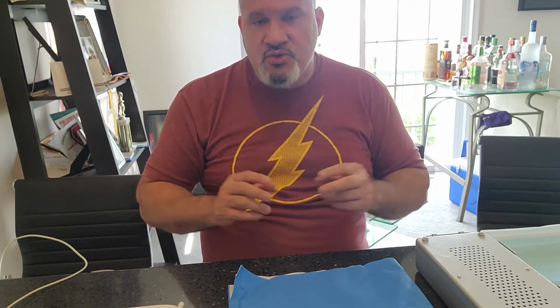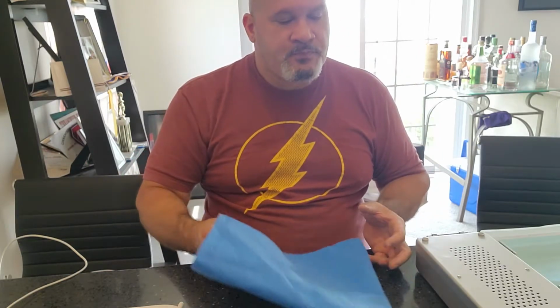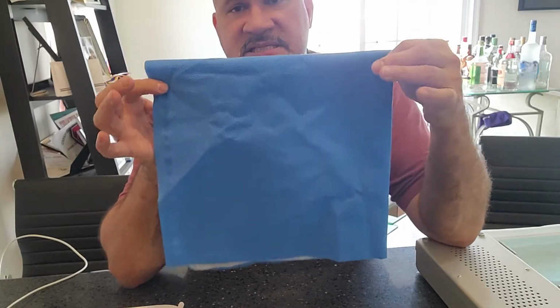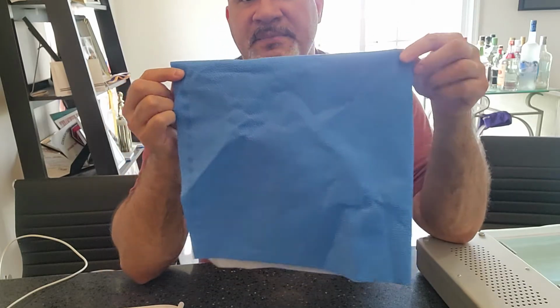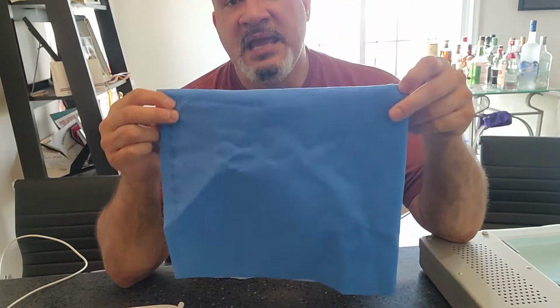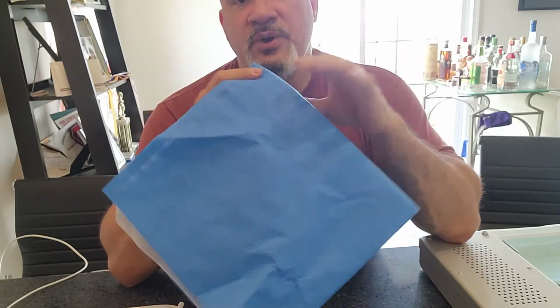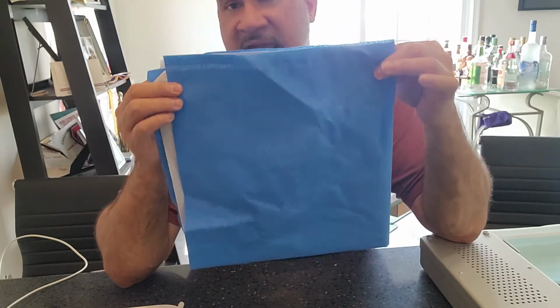And I reached out not too long ago to get a specific answer for this, and I got back my thought process. A medical device. So I know that this device, let's say I don't have the IFU in front of me, but let's say this packaging system has been validated for a 30-minute dry time. Okay, that means that this item by itself, without anything in it, was placed in the sterilizer at 270 degrees with a 30-minute dry time, and it came out dry. Anything less than 30 minutes, it came out wet. So when you pack a medical device in here, the minimum time has to be 30. It can't be less than 30.